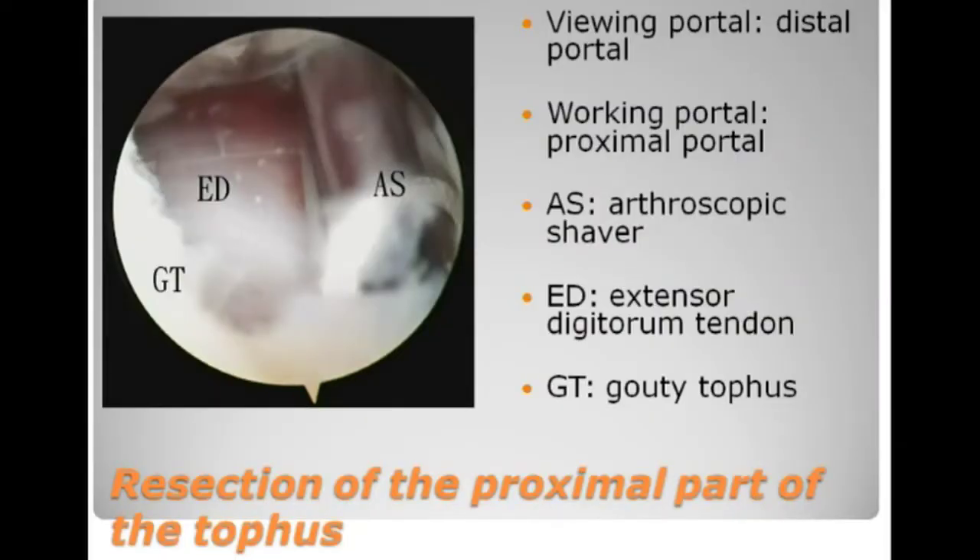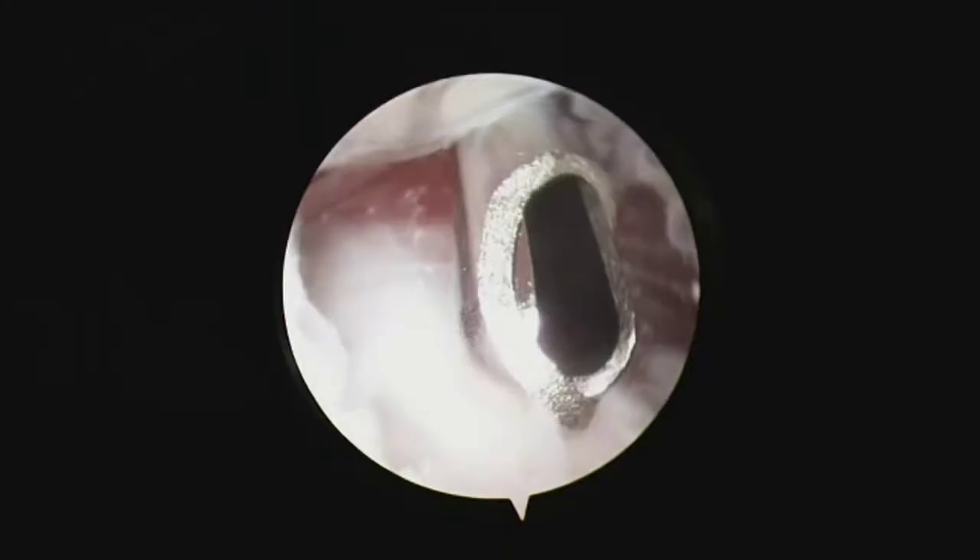The next step is resection of the proximal part of the tophus, with the distal portal as the viewing portal. The proximal part of the tophus is resected by means of an arthroscopic shaver and arthroscopic punch forceps. The extensor tendon is an important landmark and the resection of the tophus should be kept away from the tendon.